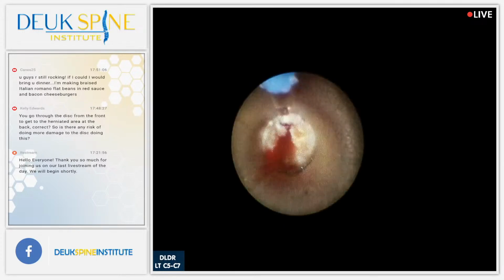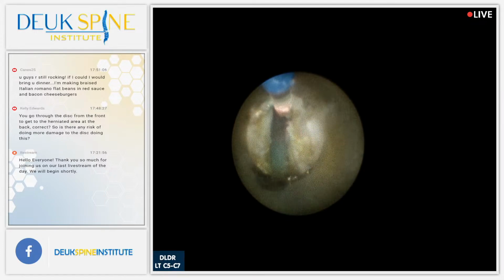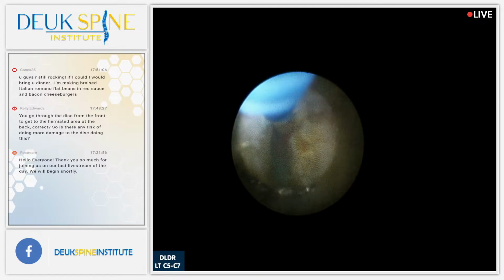Again, we float them out. Stephen King would be proud of us. They float down here.